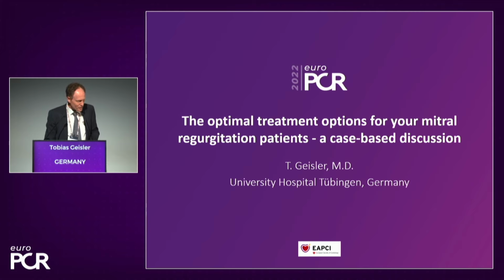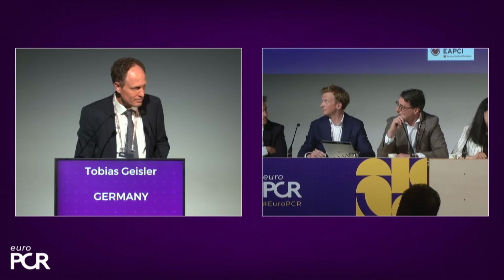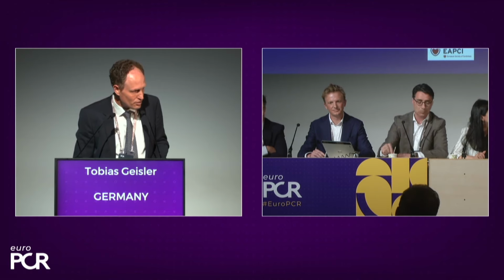Maybe I can start a short survey with the faculty, and I would like to ask you, what is the proportion of ACE and the Pascal system at your centers? Maybe we can start in Ulm. On the mitral side? On the mitral side, yes. Yeah, I think we do not use a lot of ACE cases on the mitral side. We still go along with a P10 for most of the cases, and we end up with one-clip procedures and excellent results. Okay. And in Paris?